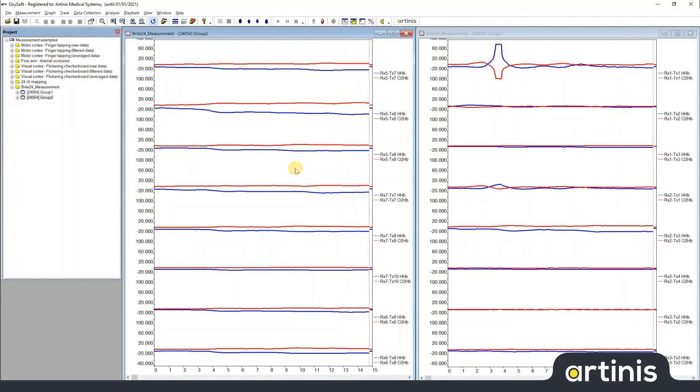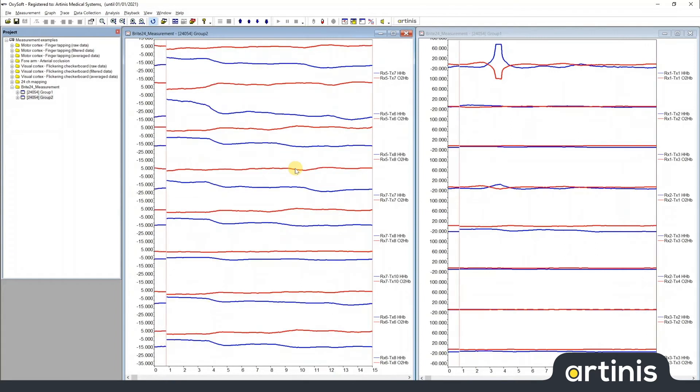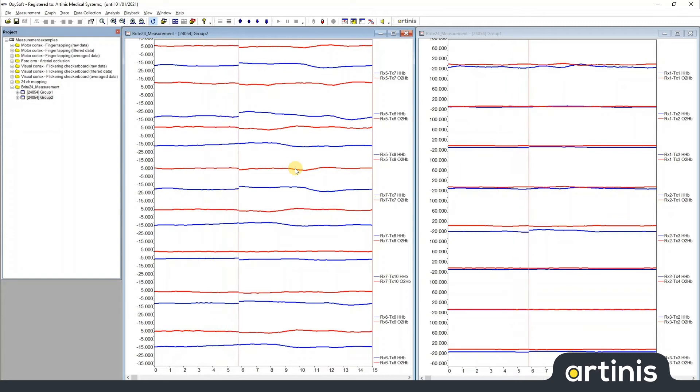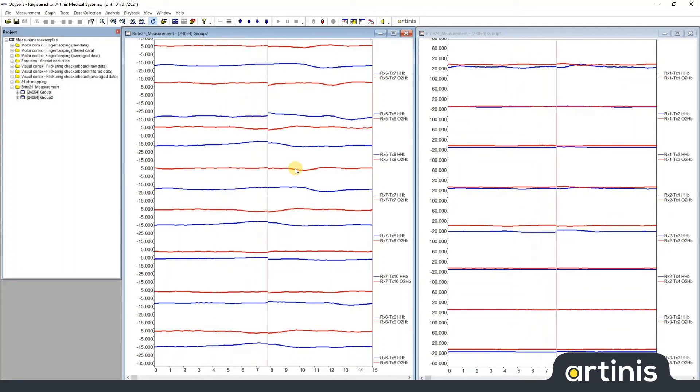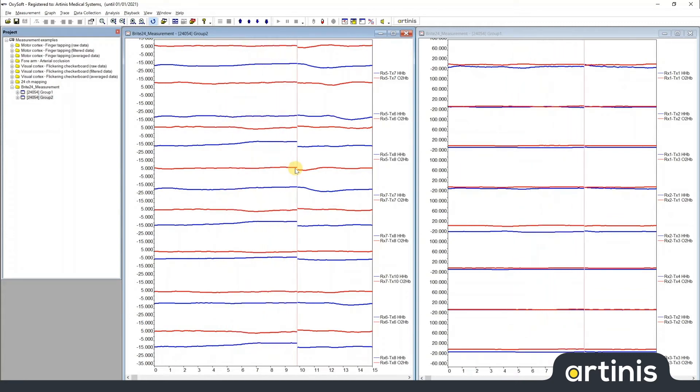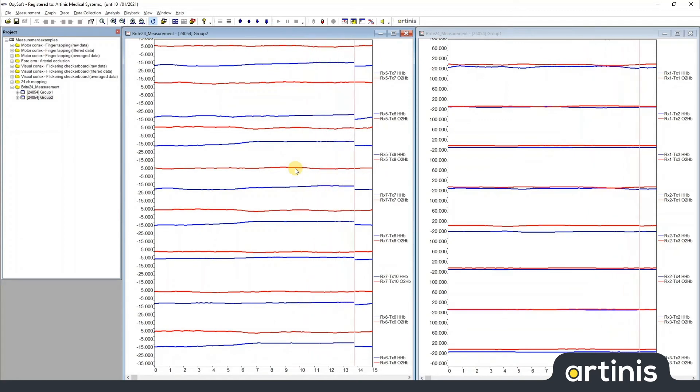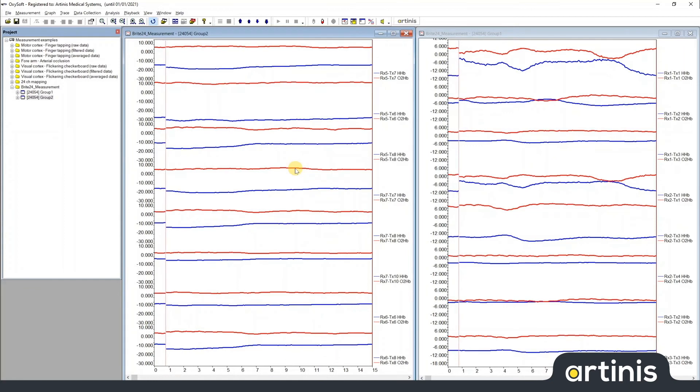The LSL event stream is automatically started as soon as you start your LSL data stream. The data is presented in an LSL stream with the name Oxysoft. The events are presented in a separate stream with the name Oxysoft events.